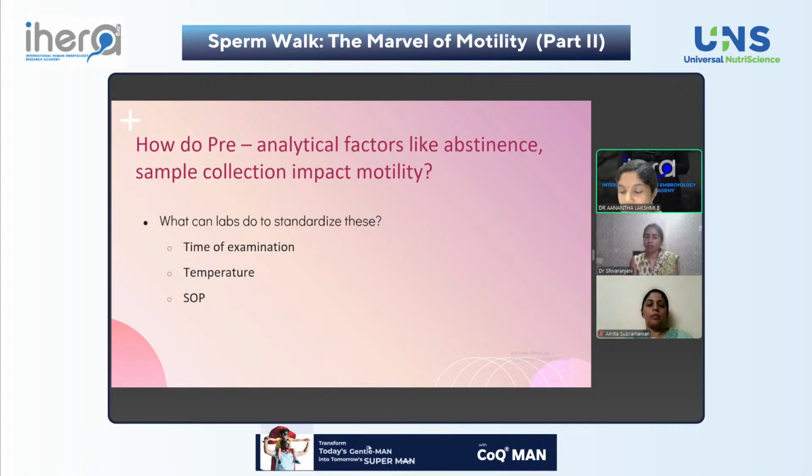Okay. Just about SOPs, what are all the things you would like to include in that? That there should be proper collection of the sample. There should not be any spillage. Okay. Any other thing? Time of examination you're mentioning about? Within 60 minutes.